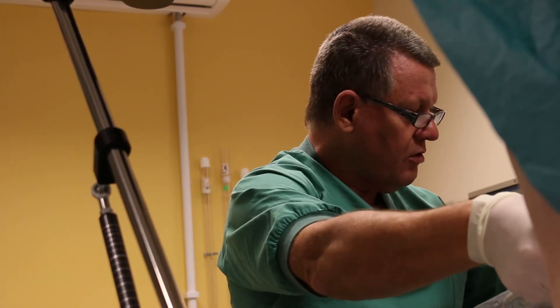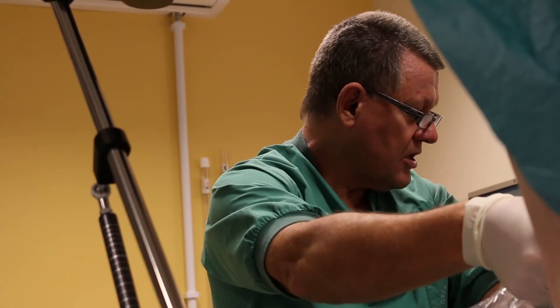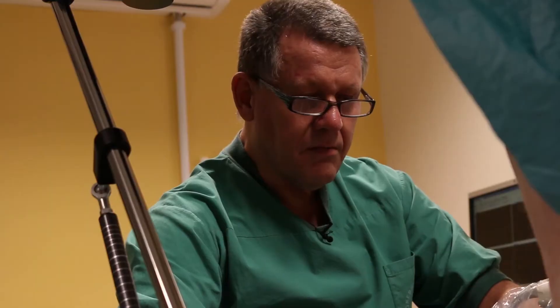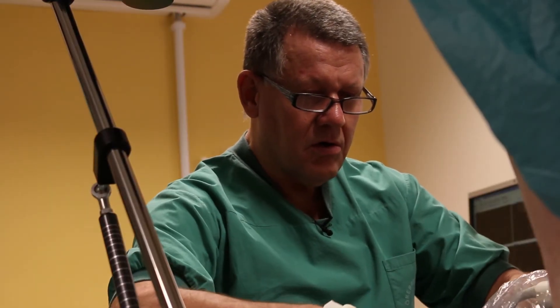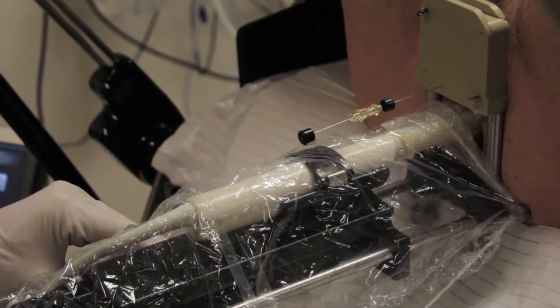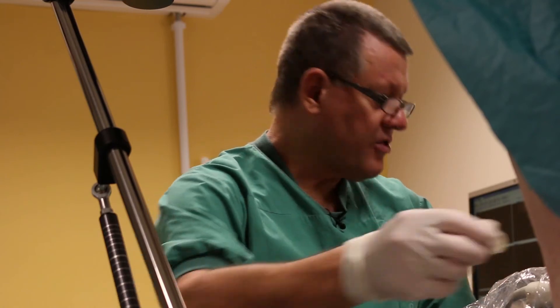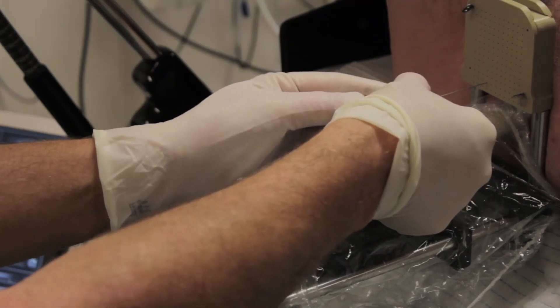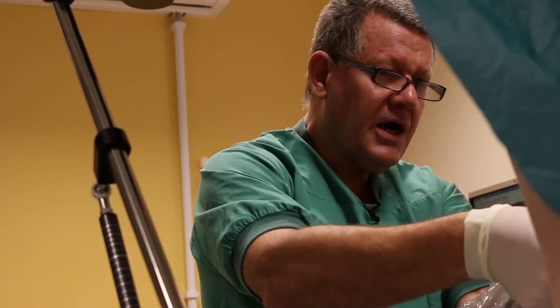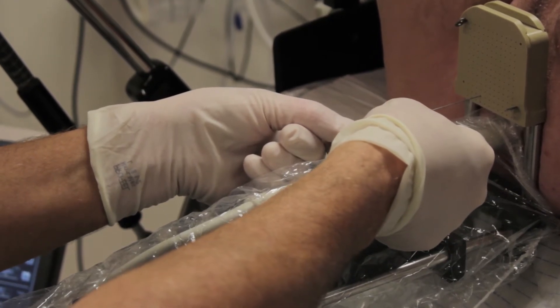We can see the echo from the needle tip exactly here, and now I will make it controlled — exactly where I am. This is the base plane and this is the apex, 38 millimeters below. Now we are exactly in the middle of these two points. Here is the needle tip, and then I hold the obturator and move the needle out like this.